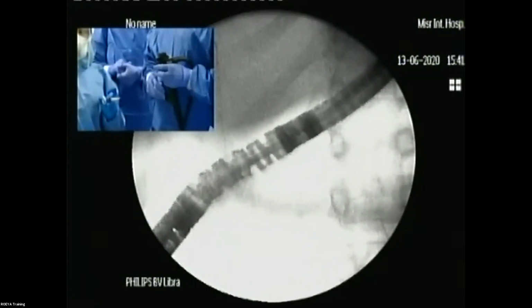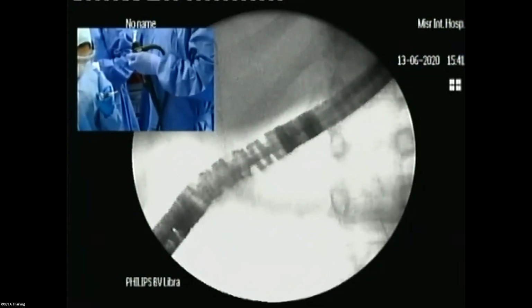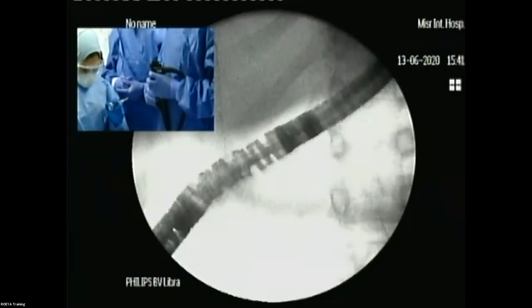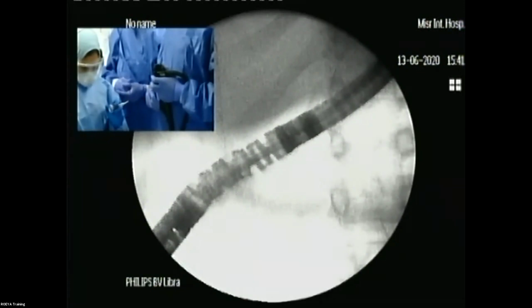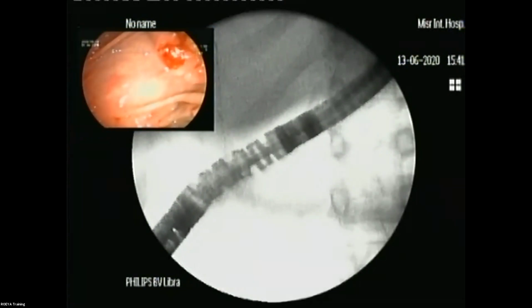Dr. Hani, by the way, I do prefer sometimes, before removing the metallic stent, to wash and make turbulence inside the stent and inside the common bile duct with saline solution. This may help to remove the debris and tissue that may interfere with removing the stent easily.